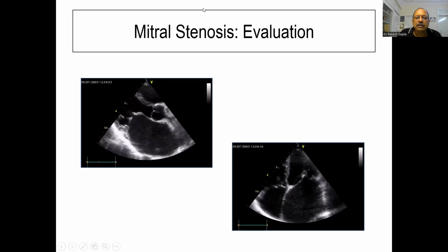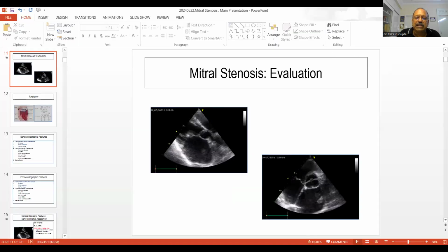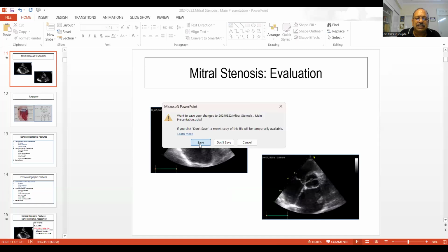All right. So, Mohammed, now it's done. I think that question is done already. Any questions again for mitral stenosis? Let me just quickly finish my tricuspid stenosis. Arnab, you want to ask something? No. All right. So let me stop over here for mitral stenosis. And tricuspid stenosis is very easy. Believe my words, it's the easiest thing you can ever do.